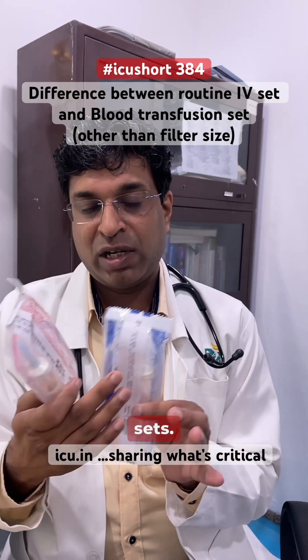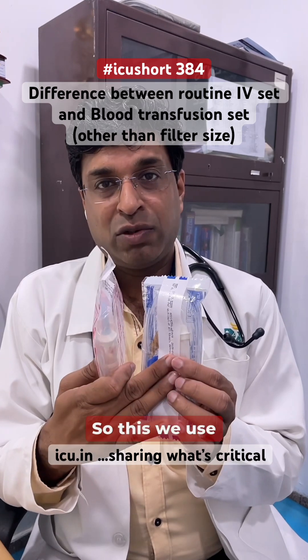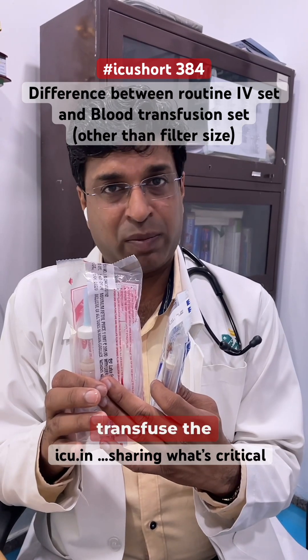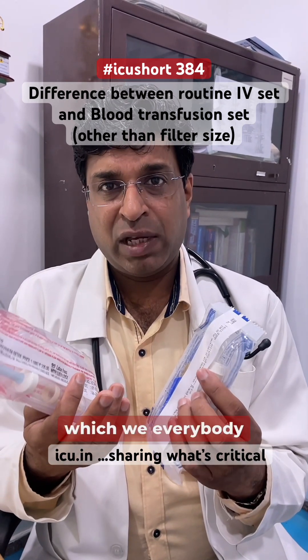These are two transfusion sets — one is your routine IV set and the other is the blood transfusion set. We use the routine IV set to give IV fluids like normal saline or Ringer's lactate, and we use the blood transfusion set to transfuse blood products like PRBC or whole blood.